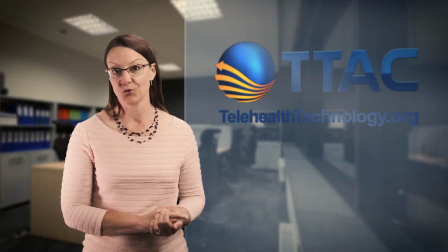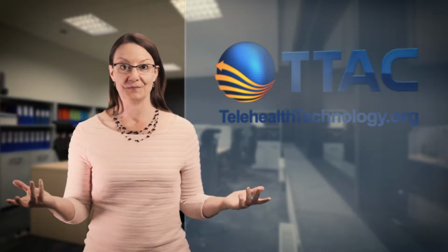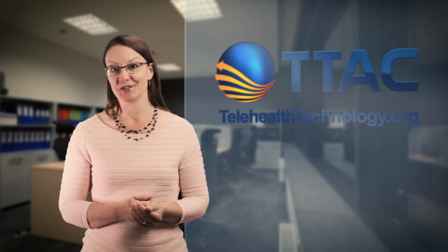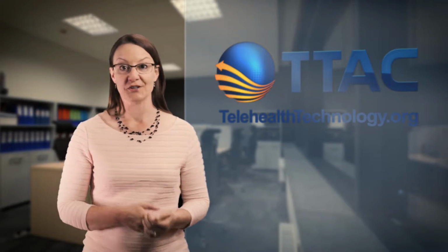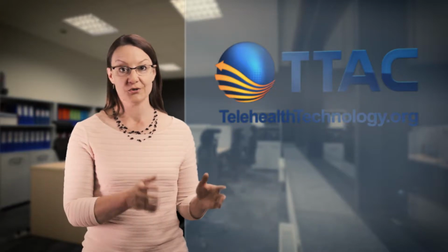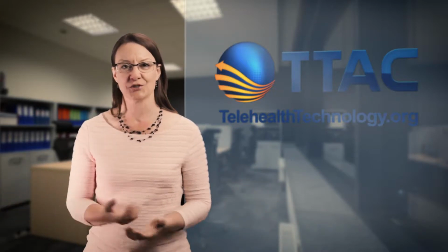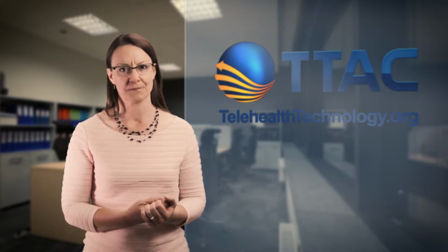I often field calls from people looking for the best stethoscope to use for telehealth, typically in conjunction with some form of video conferencing system. So which is the best stethoscope? It depends. It depends on the video platform you're using. It depends on the computer skills of the users. It depends on whether you need audio, serial, USB, or Bluetooth inputs. It's a hard question to answer because it depends on a lot of things.